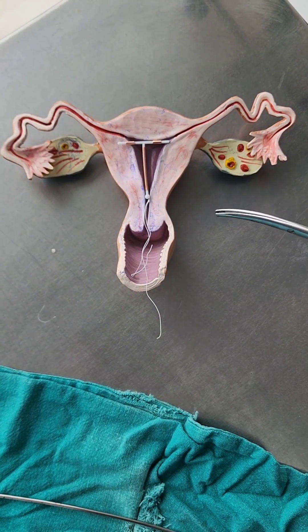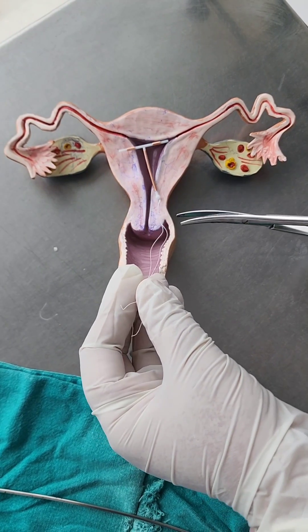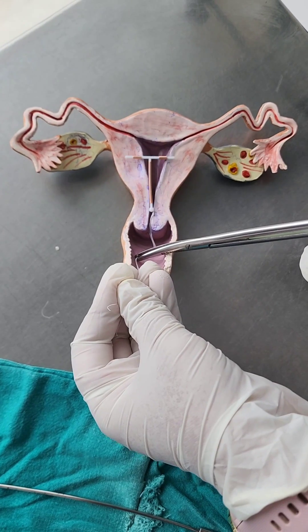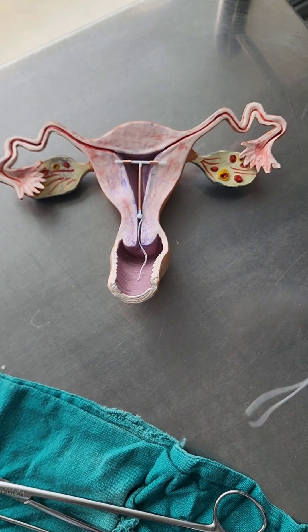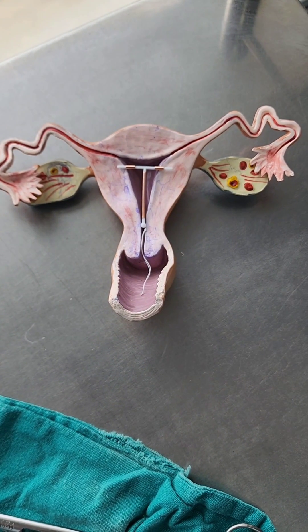The copper T is now inserted inside the uterine cavity. We cut the thread so that approximately 2.5 centimeters of thread is retained beyond the cervix. We then let the patient feel the copper T thread so she knows how to check for the copper T.